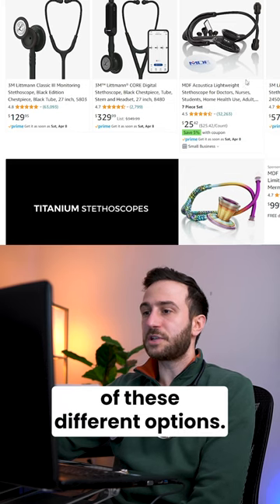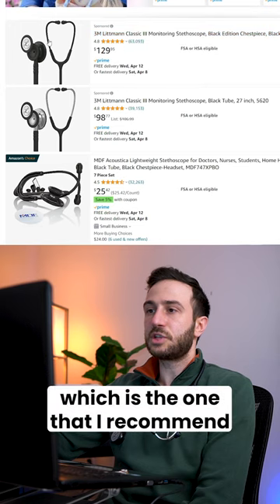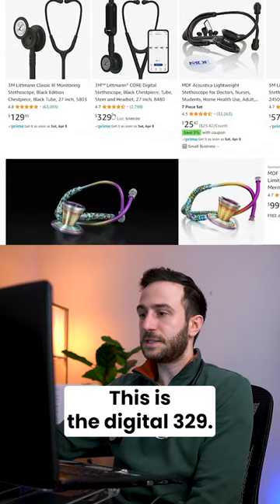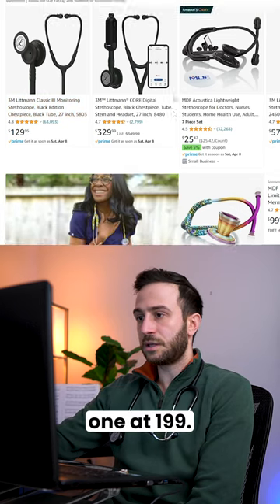Let's look quickly at the prices of these different options. The Classic Class 3, which I recommend for medical students, starts from $129. The digital stethoscope is $329, and the cardiology one is $199.